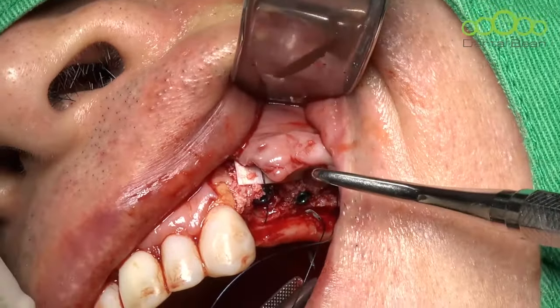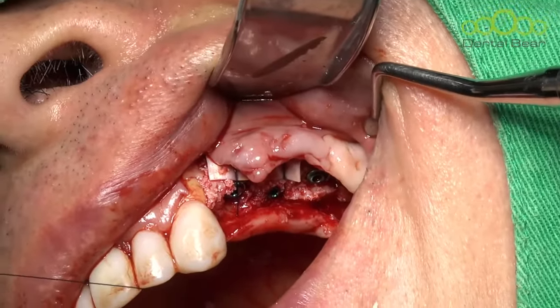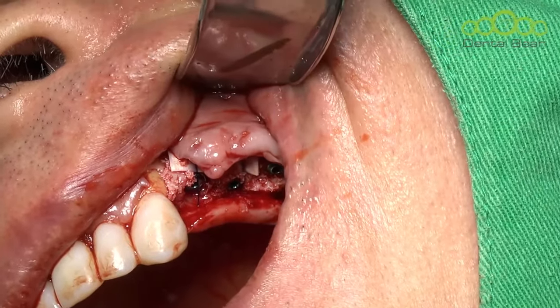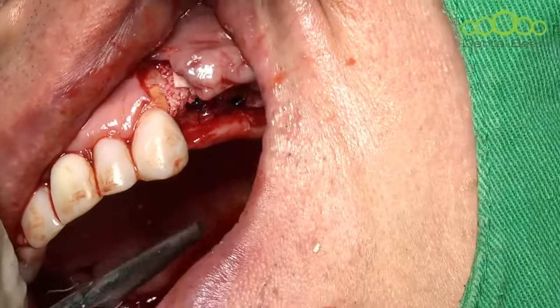And this suture, which is used to stabilize the membrane, should be removed about 3 weeks later. This key suture will be removed 3 weeks later. And at the other site, I will remove the stitches about 10 days later.